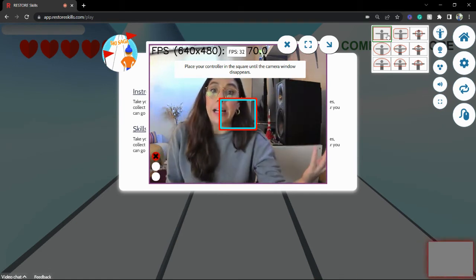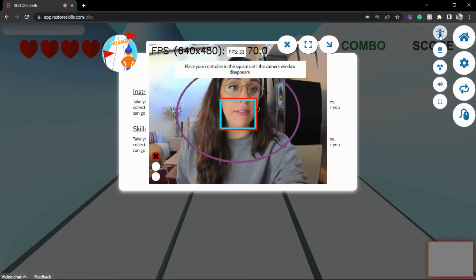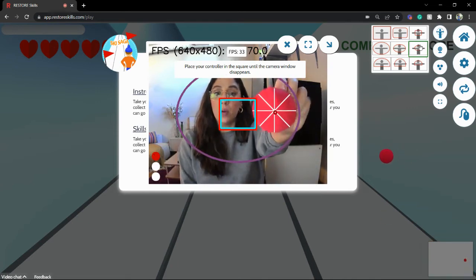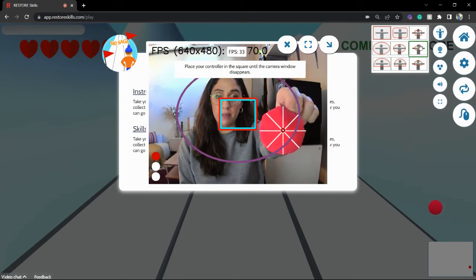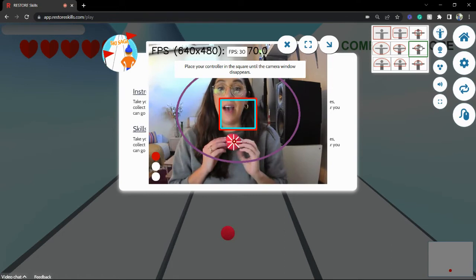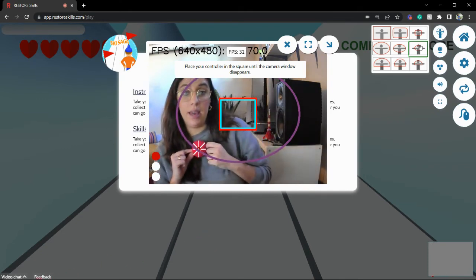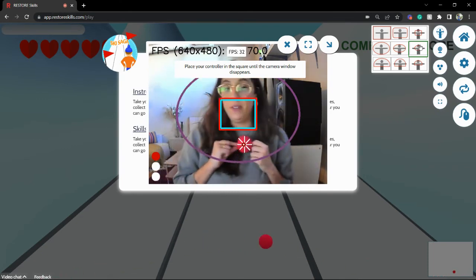But if I had a frozen shoulder or arthritis, I needed to have smaller movements, I can find something like that purple oval. It's very small. Once I bring up my object, now I can look at that, use wrist movements, and I'm still engaging with the activity on the screen. Rather than having to stand or take steps, I can now weight shift. And I can engage here with the game Ski Saga by switching lanes, and I'm just slightly shifting my weight.